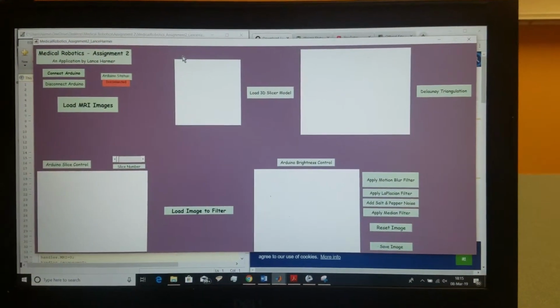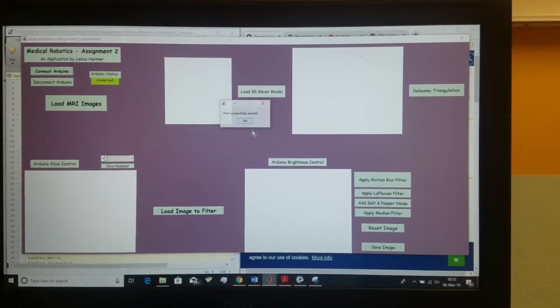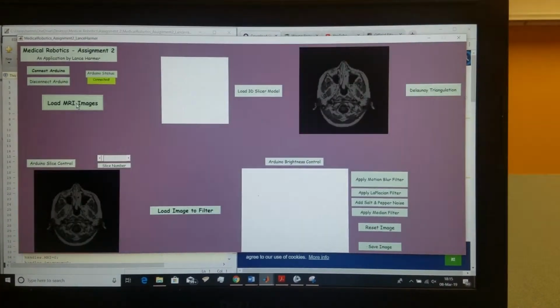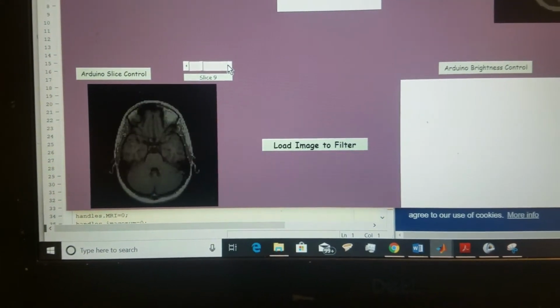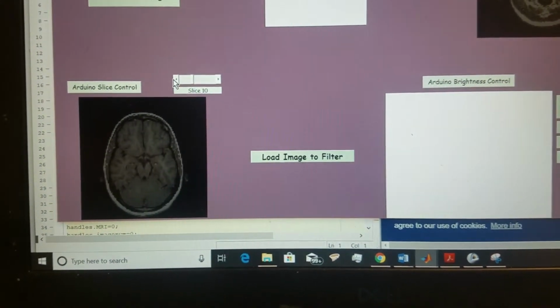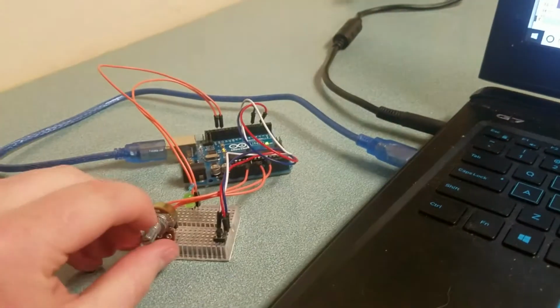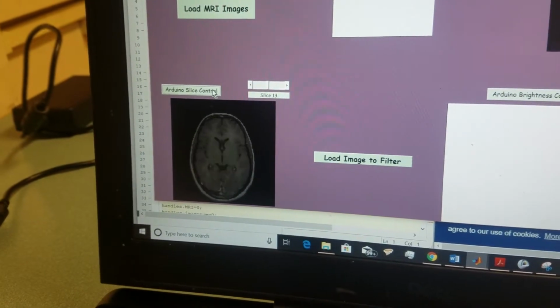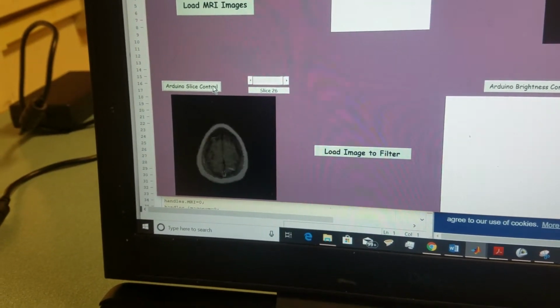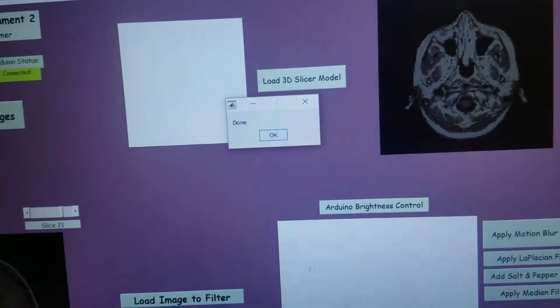The first look at the GUI here, we're going to first connect the Arduino, and then get a little dialog that says it was connected, and then load the MRI images. Down here for the slicer, you can see that as we scroll through these, the little tag there updates saying which slice we're on. But also, if you choose to use the Arduino slice control, with this hardware here, you can turn the potentiometer knob and actually go through the different slices that way, from 1 to 27 completely. To terminate, you press the button on the circuit, and it says done.